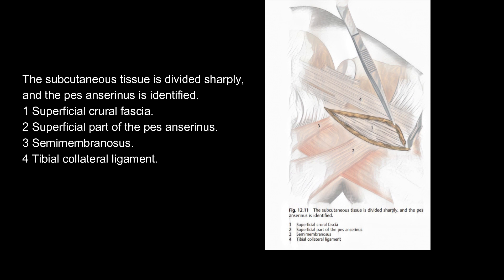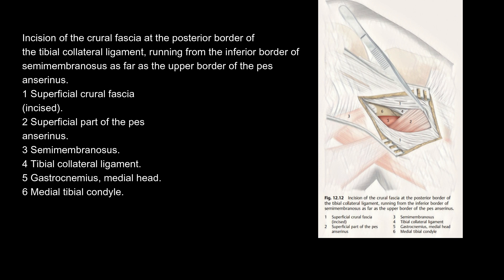The subcutaneous tissue is divided sharply and the Pes anserinus is identified. Structures visible include: superficial crural fascia, superficial part of the Pes anserinus, semimembranosus, and tibial collateral ligament. The crural fascia is incised at the posterior border of the tibial collateral ligament, running from the inferior border of semimembranosus as far as the upper border of the Pes anserinus.